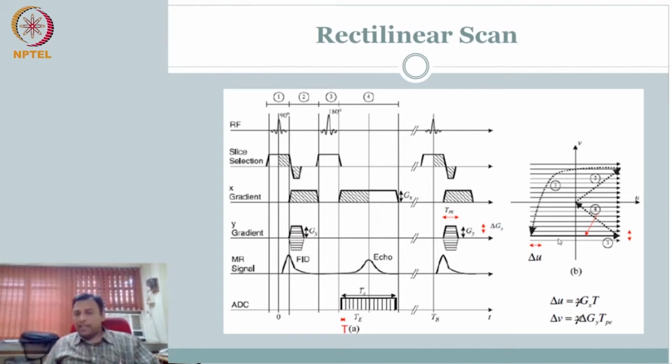So we have been putting this arrow line, but more correctly what we should have put is a sequence of dots. And the distance between the two dots, or the two samples, would have been delta U here. In this direction it is intuitive. We always put discrete steps. Okay, so this is what we have.